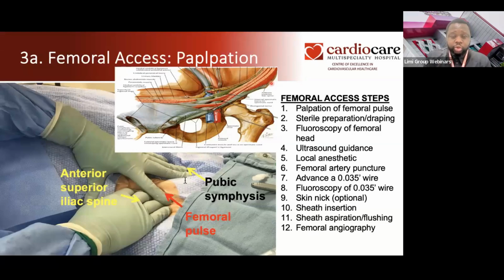Dr. Kwebo, thank you for joining us. Please, do you also give heparin prior to cannulation in coronary angiography? So typically, some people have talked about giving heparin. I'm just answering one of the questions in the chat box. Some people have talked about giving heparin for coronary angio. But generally, as a rule of thumb, most operators worldwide do not routinely give heparin before routine coronary angio.